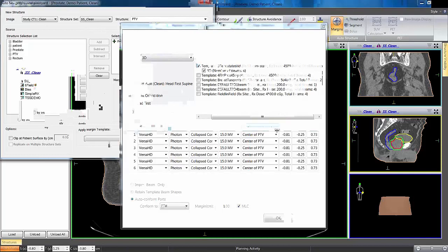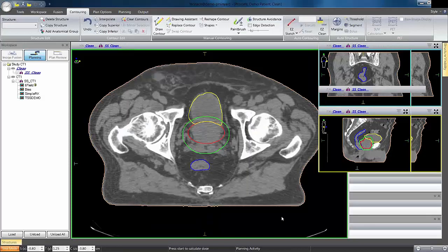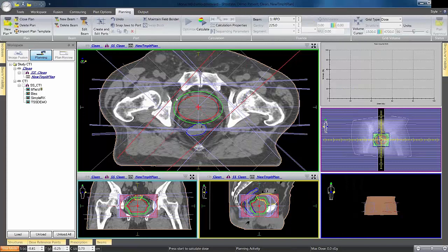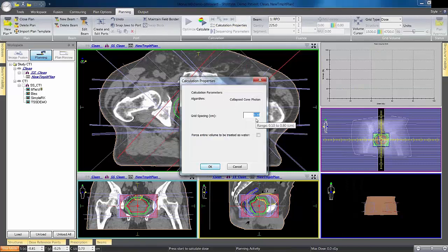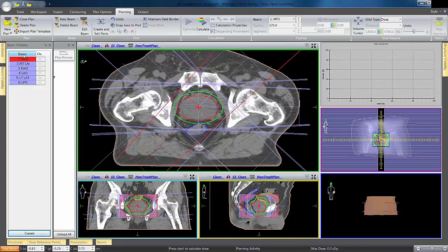Head-first orientation—these are the beams associated with this template. If you want to change the machine, energy, algorithm, or where to place the center, it's all a dropdown. I'll load these beams and put a margin on the PTV for the MLC. The calc properties come over with the template. If you don't want a grid spacing of 0.3, you can change it. The templates are a starting point—they might be exactly what you need, or you may need to change things. The prescription tab also comes over with the template: 4,500, 25 fractions, 180 a fraction.